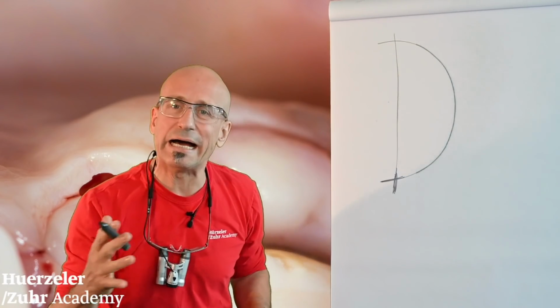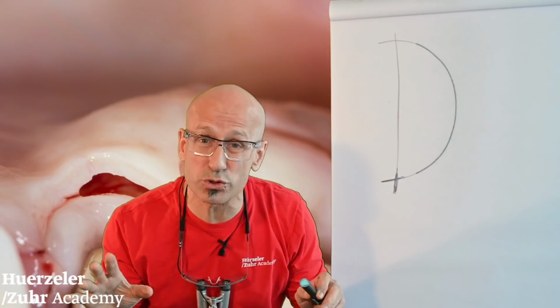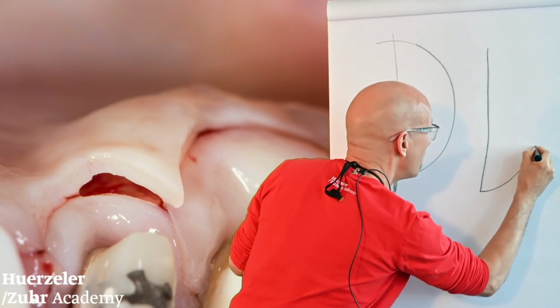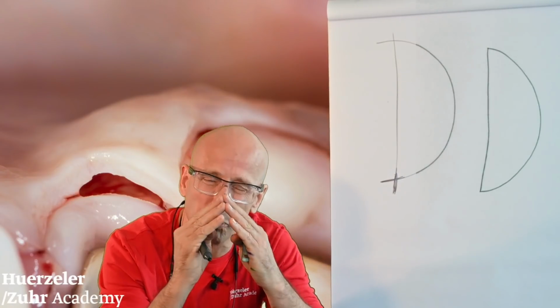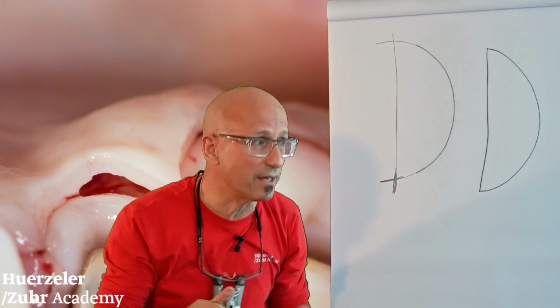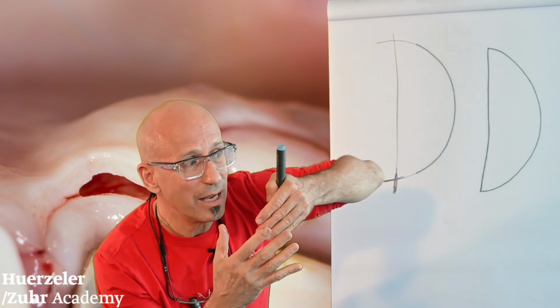You know, humans think we are only a good surgeon when we work like this. So we think this is much better because now we have a perfect cut exactly in the corner. But now think about what happens in the deepness.